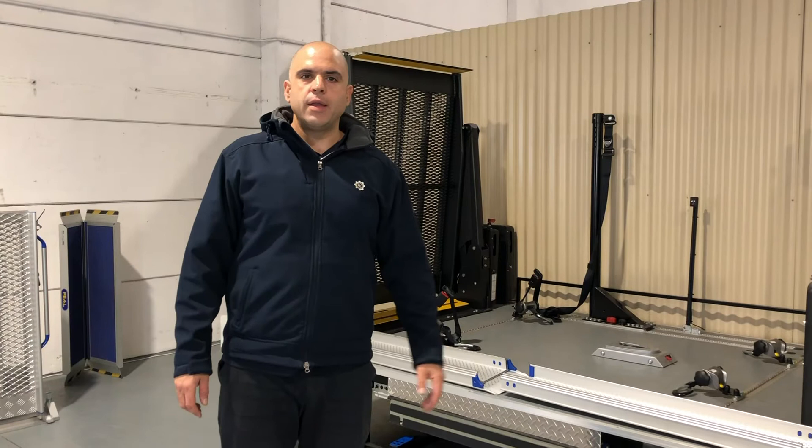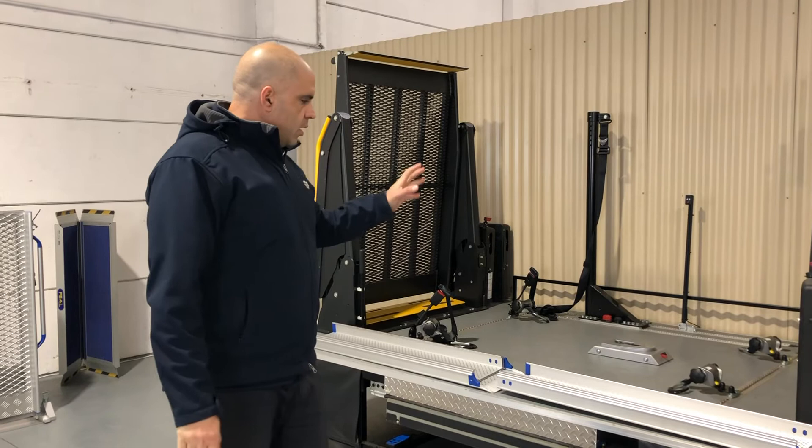Hi and welcome to another product information video from Mobility Engineering. Today we're here to talk to you about the FEAL Telescopic Portable Lightweight Ramps.